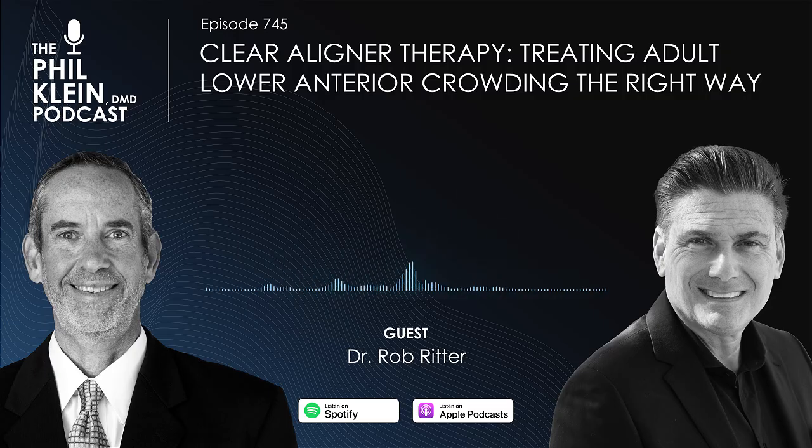I said, "It's not about the way they look. That's the benefit at the end, that they'll look great. What I'm really concerned with is the teeth are not in the right position." And if you take a look at the opposite teeth, the opposite arch, you notice the wear that's happening either on the edges of the teeth on the upper or behind the teeth where the bite is collapsed, and you can see the notches that are occurring or the wear facets on the posterior teeth.